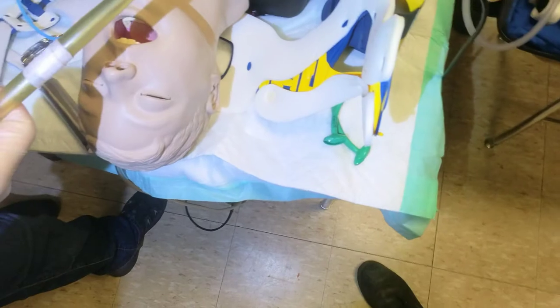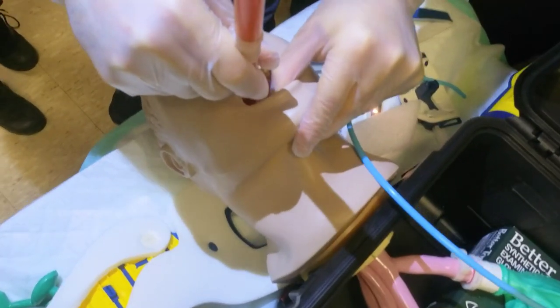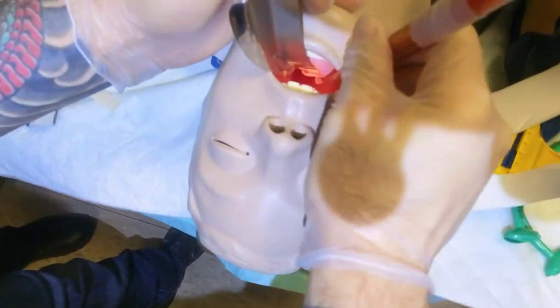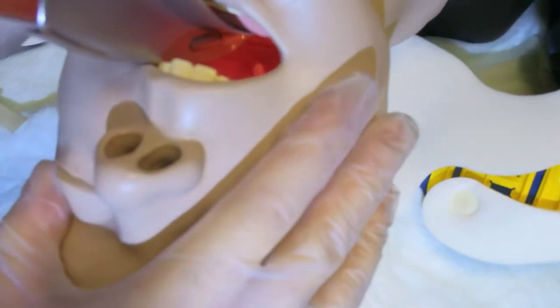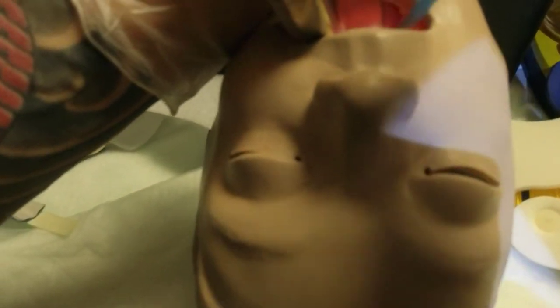We're going to lead with the laryngoscope. I clean a little, then start inching along the tongue clearing as I go — clearing to the epiglottis. I see the epiglottis, I sit my blade in the vallecula. Then I remove the suction from my hand, park it behind my blade, and move it all the way to the esophageal space — wedged there. The laryngeal inlet isn't a good view, so now I've got to use the bougie. We come in with the bougie — how do I know I'm in the right place? I feel hold-up. Don't remove the blade — it stays in place — and then my partner laces the tube over the bougie.